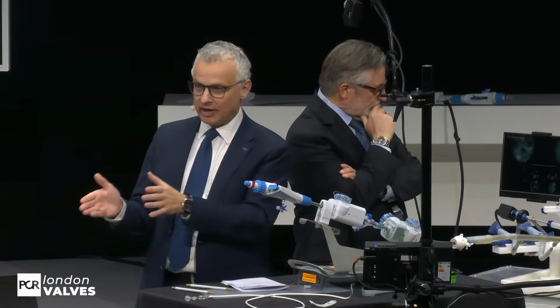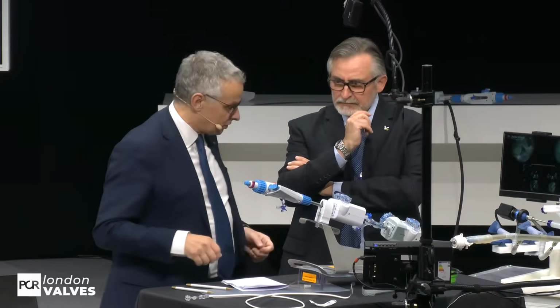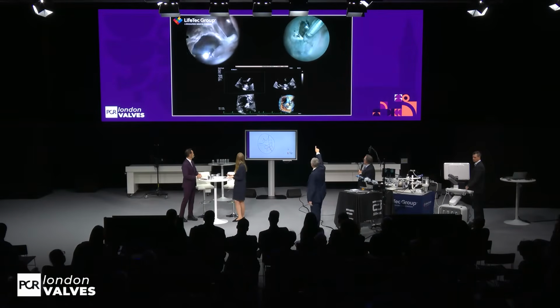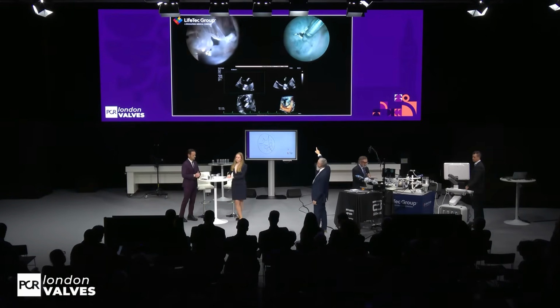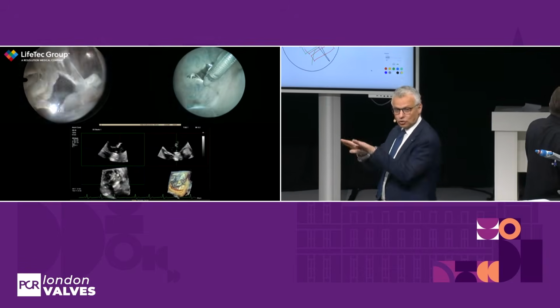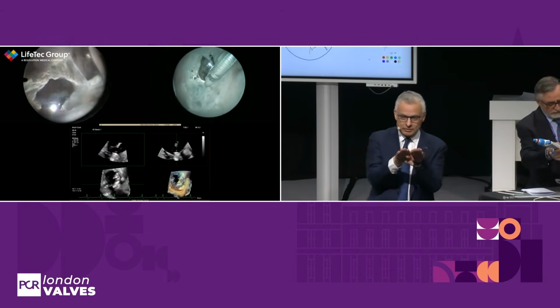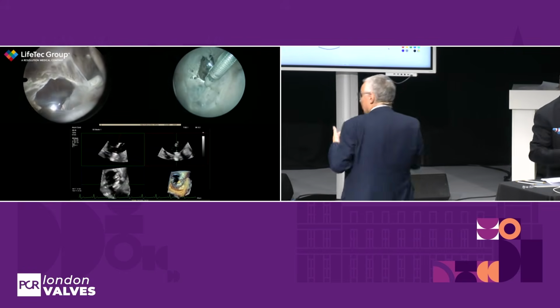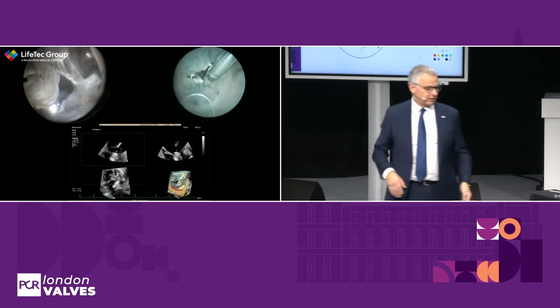because the clip is both a coaptation device and an indirect annuloplasty device. So you only correct one side of the annulus. Second, you risk creating tension in this commissure. I don't know if we have a pointer. No. But look at the screen on the right side, and you see how the postero-anterior indentation is spread open. That is the risk you encounter when you do this technique, particularly the more posterior you go.